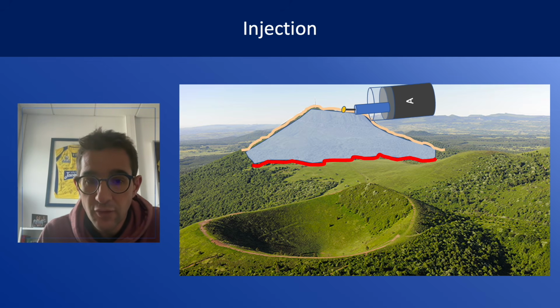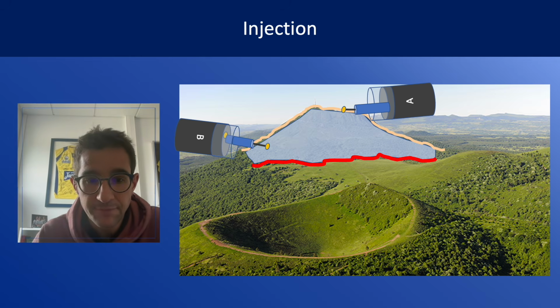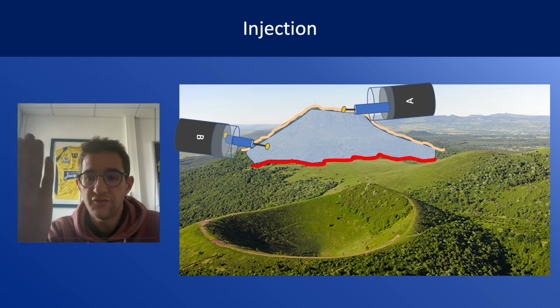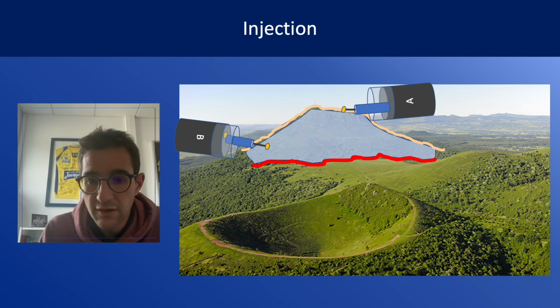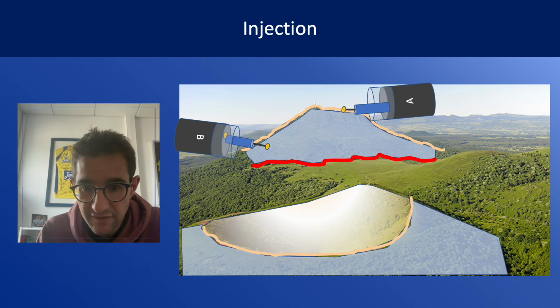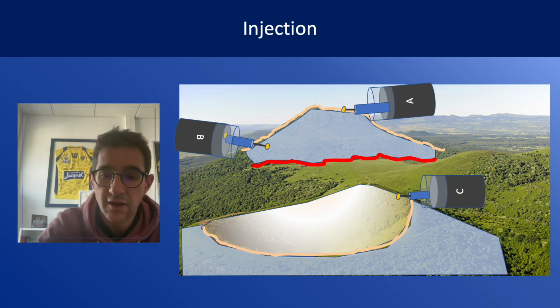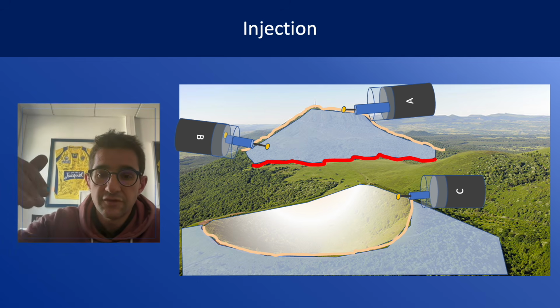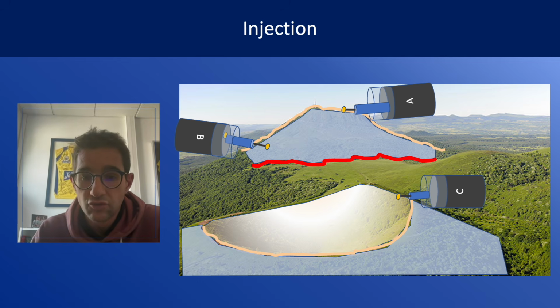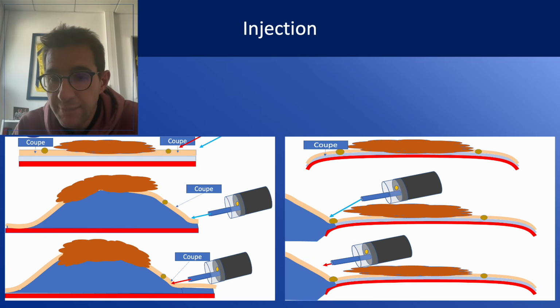It's very difficult to enter the tissue for doing the incision at the top of the mountain. It's better when the mountain is facing you. And if you want to know more, please see the episode about injection in the ESD school. The most difficult injection is to inject in a fold, in a downhill, because it's very difficult with the down wheel to go into the tissue and have a deep incision. After, you will try to do a helping incision.